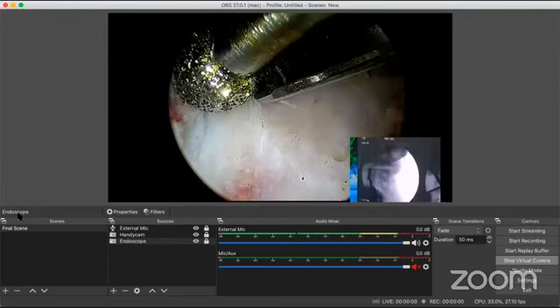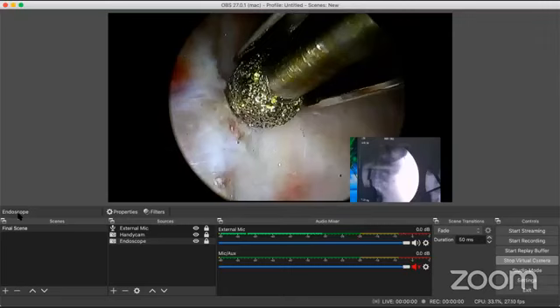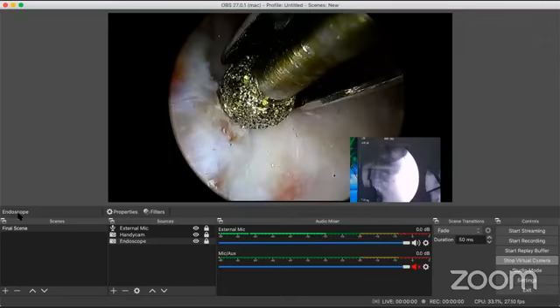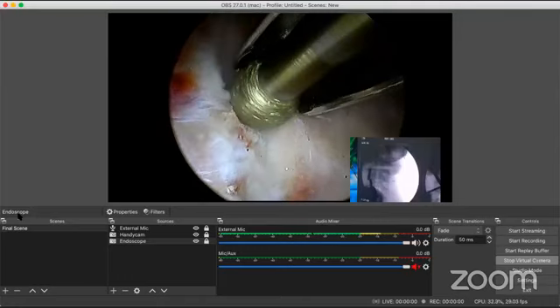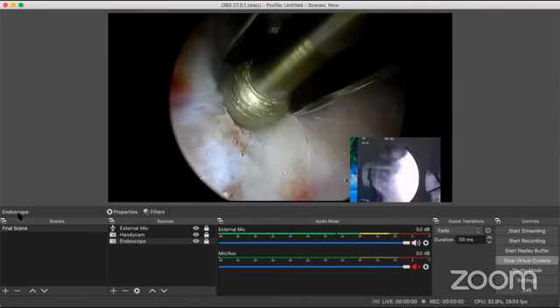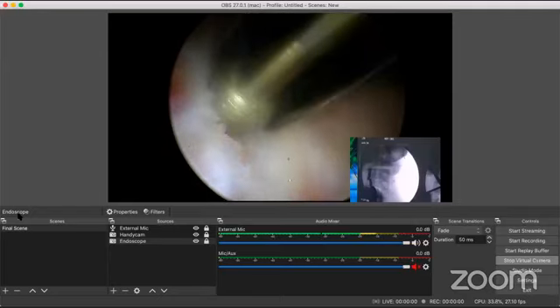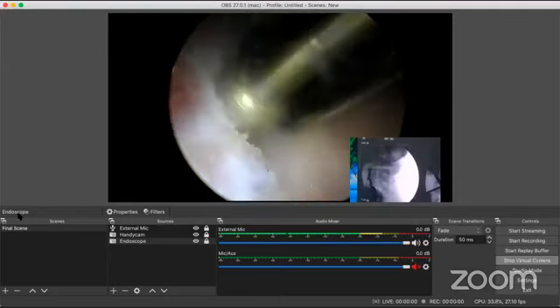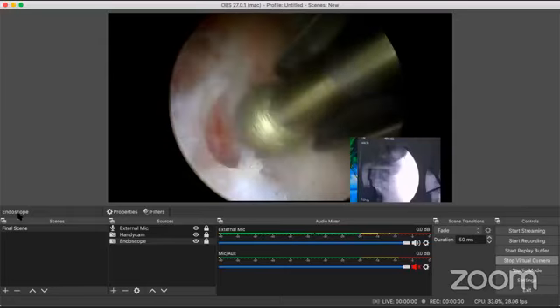Now that is exactly the point beyond which there is no osteophyte going to overlap. So I don't want to cut beyond that. Burr here, please. So I'm going to mark this as my end point of my lateral transgression of the facet joint. I'm not going to go beyond this point and disturb the facet further.